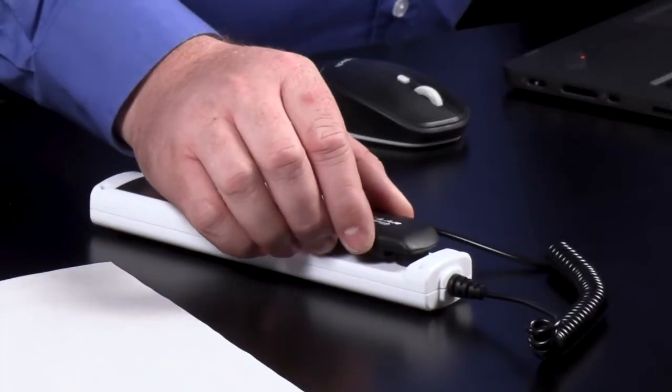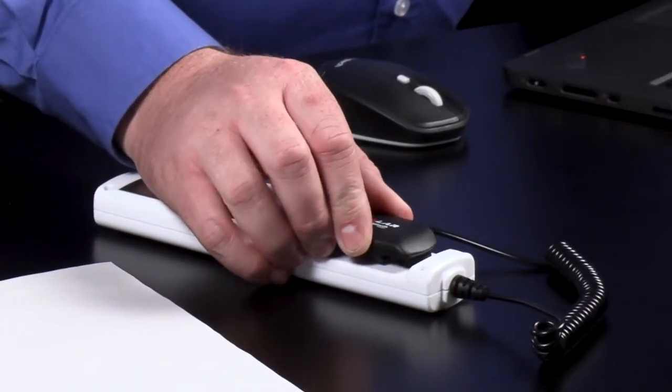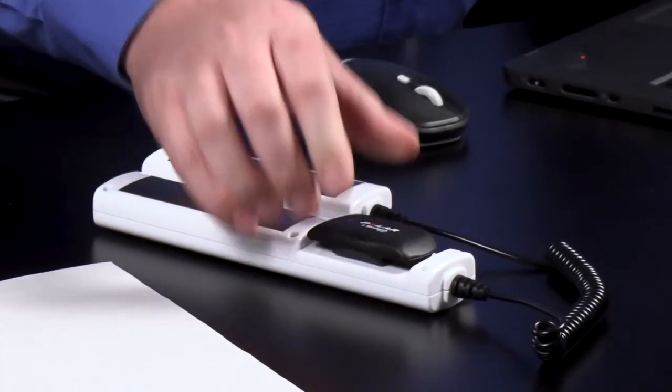We'll demonstrate using the sensor with the hand grips, but the process for the chest strap is exactly the same. First, we'll place the heart rate module into the hand grips. It simply snaps into place in any orientation.